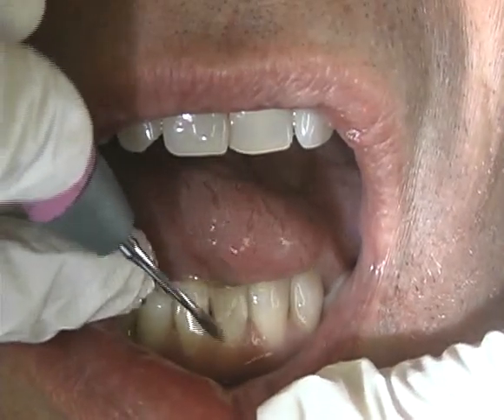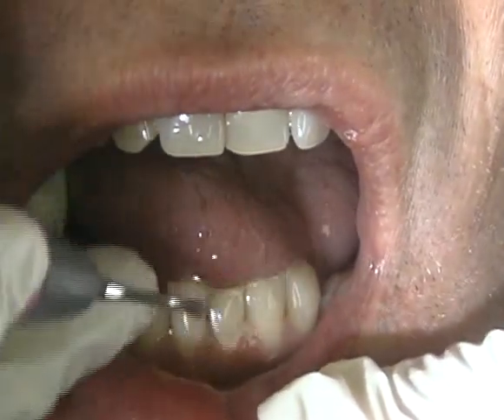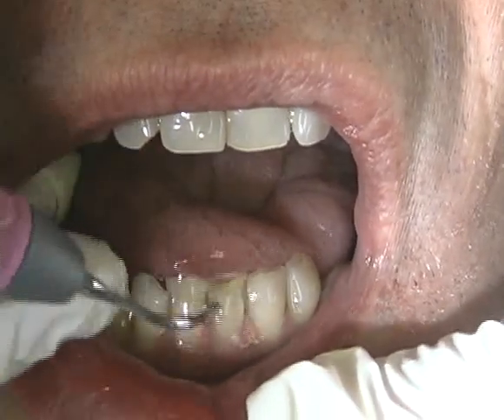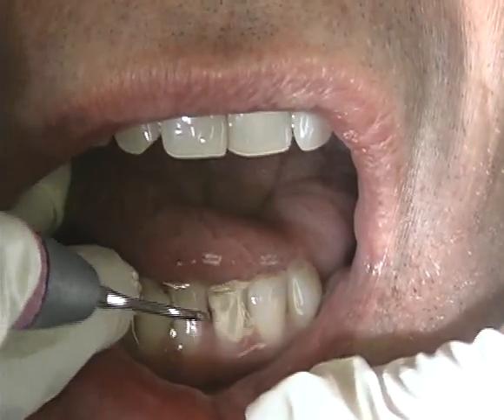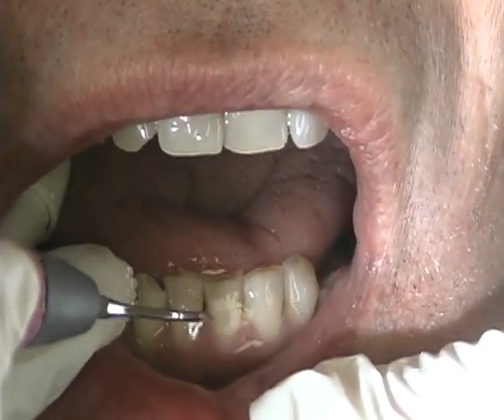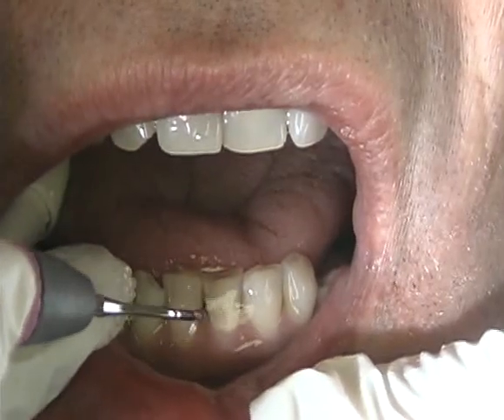Adapting the front, concave, and back, convex surfaces of this Universal No. 10 instrument will provide additional power when needed for heavy calculus removal. The No. 10 Universal is most effective on medium to high power settings.